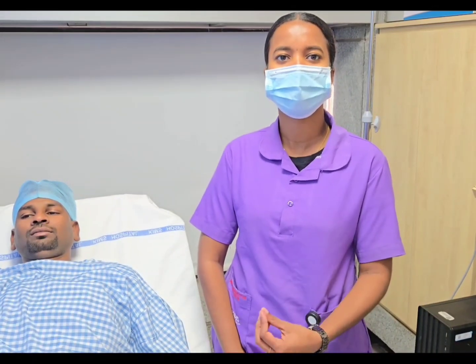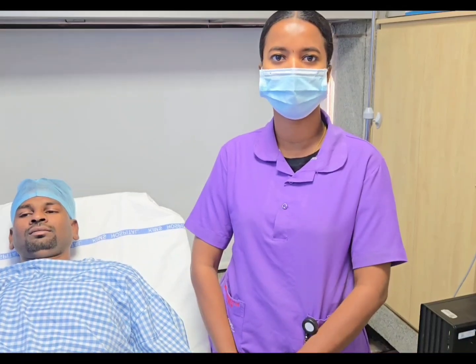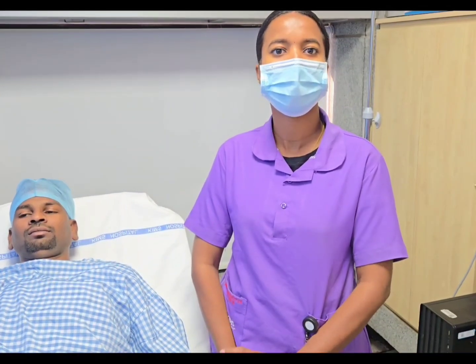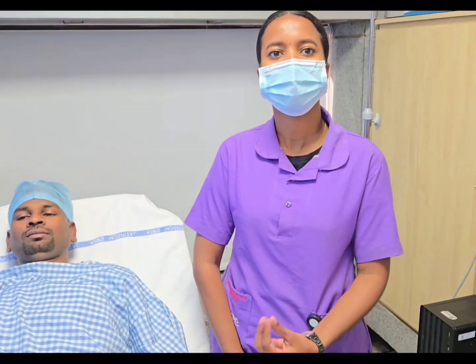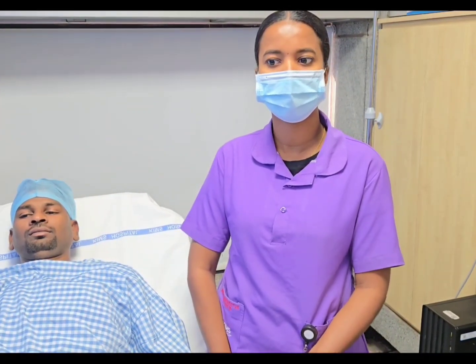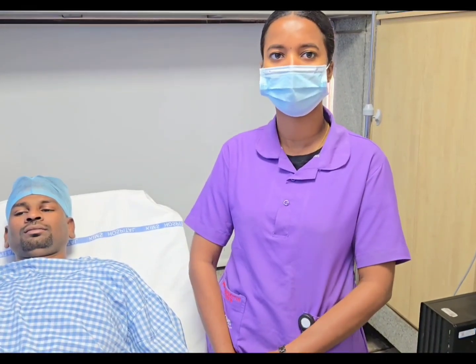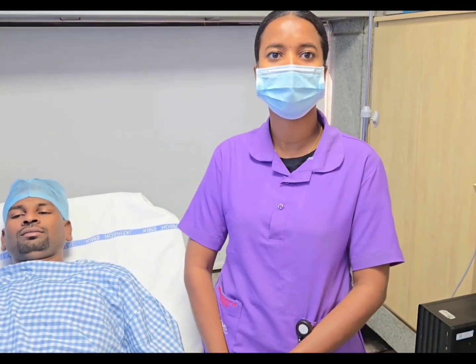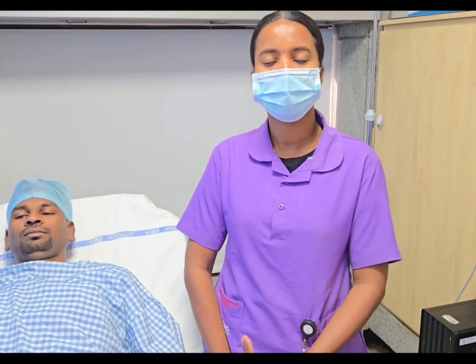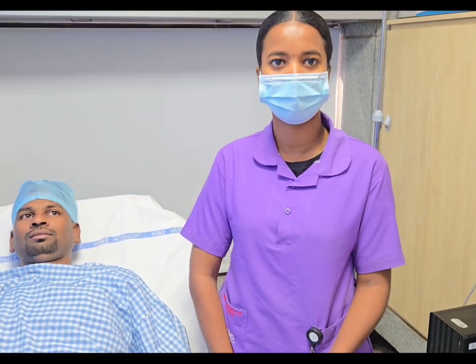For which patients are we using this? This is only used for conscious or semi-conscious patients. We do not use this NPA for unconscious patients. What are the indications? We use this NPA for upper airway obstructions, for any patient with altered sensorium, for seizure patients, or if we are giving any sedation.